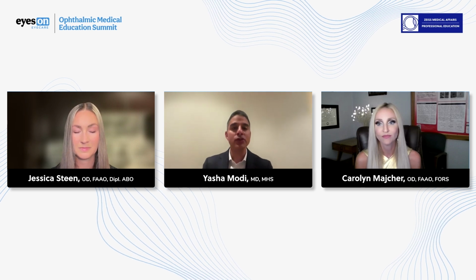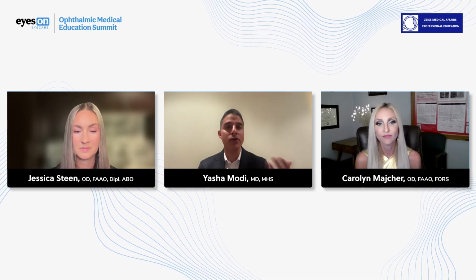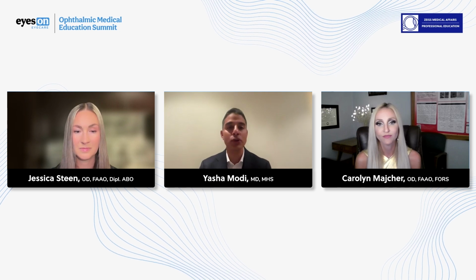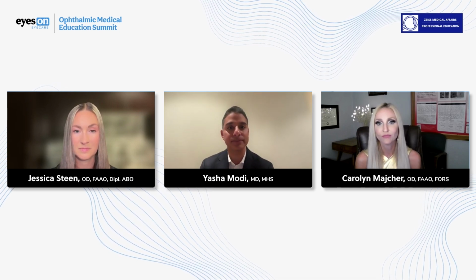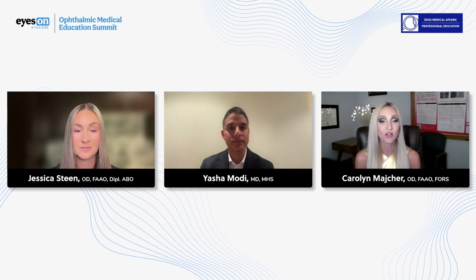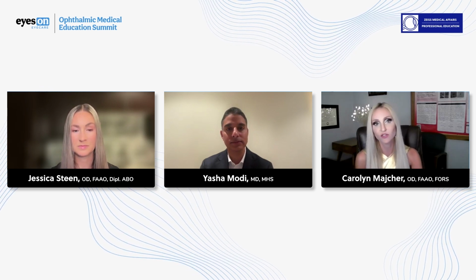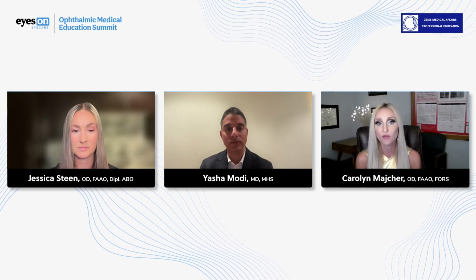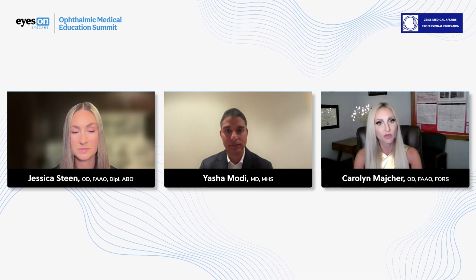So when you guys are thinking about that, are you getting fundus photography, OCTA, OCT? What's your strategy when you're looking at these patients? Yeah, for me, I find a whole lot of value in the OCT angiography because it highlights those collateral vessels or retinal telangiectasias, like you had mentioned, and you can isolate things like that in the deep capillary plexus.